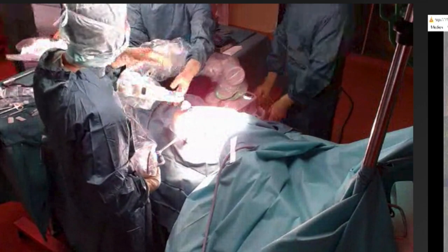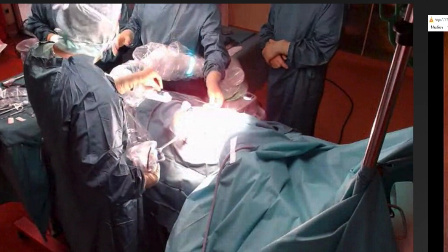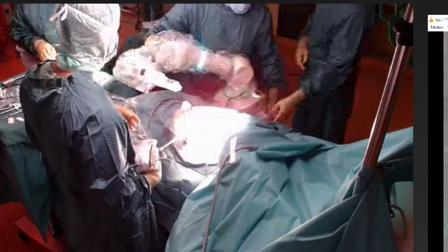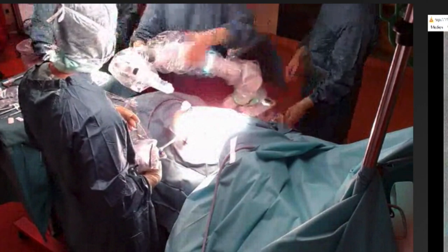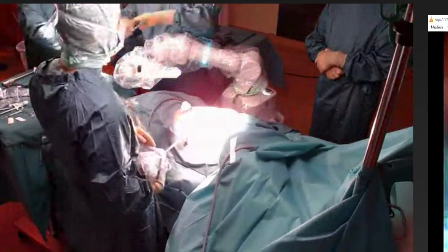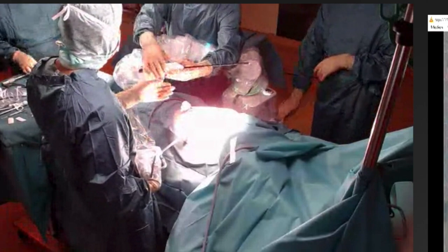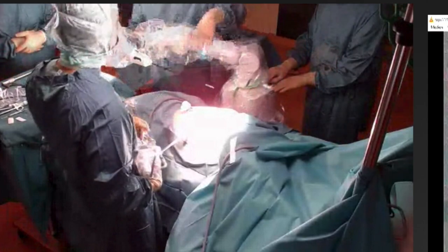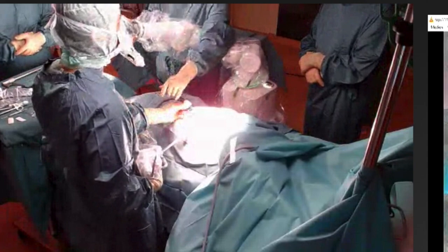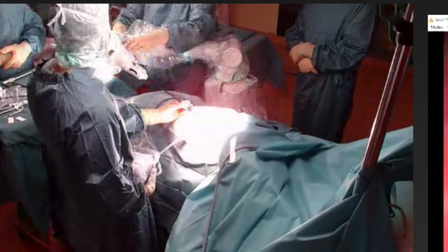Hello, my name's Joel Dunning and I've got great pleasure in again bringing you Sven Seifert and the fantastic team in Chemnitz who are really flying with the new CMR Surgical Versius Robotic Thoracic Surgery system. I just wanted to show you a few images. This is Sven and his team setting up the robot. As you can see it's a very different system to other robots. The arms are held like a sword and really nice small individual modules. We can see them inserting the instruments here into the chest.